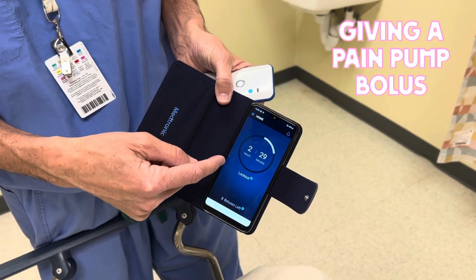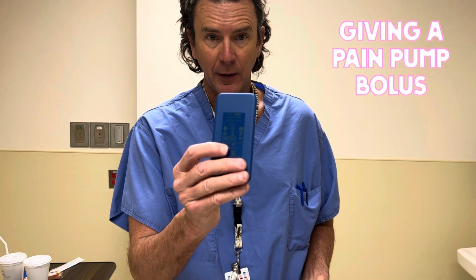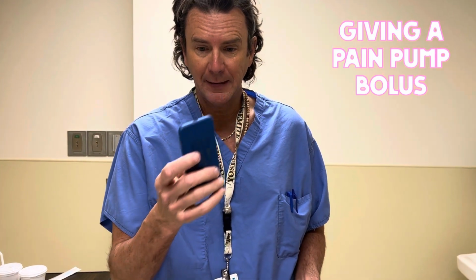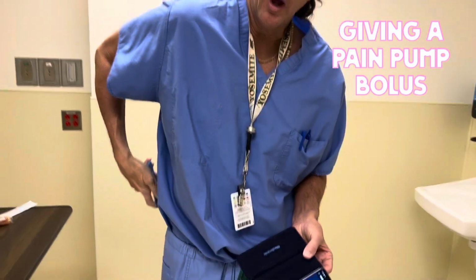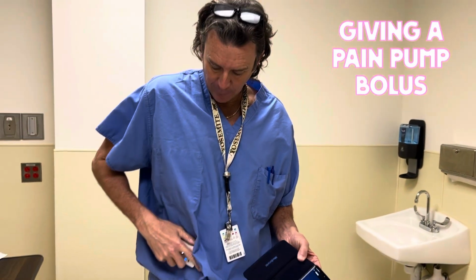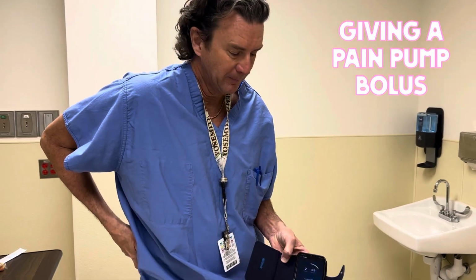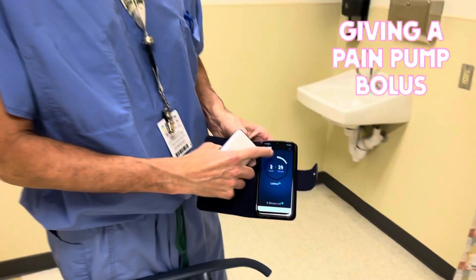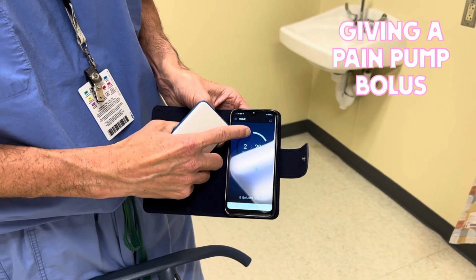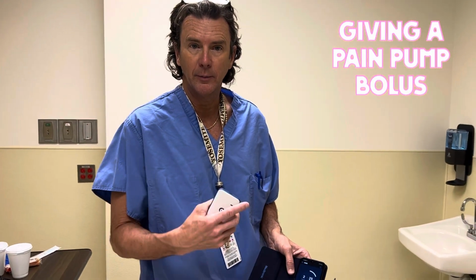So if we want to give a bolus dose, if it was down to 0, what we would do is take this handheld device with the blue side down. We hold it over the pain pump. The pain pump is usually in the back, sometimes it's in the belly, but you would hold it over the pain pump. And if this was down to 0, there would be an arrow here, like a play button on a VCR or some sort of device.